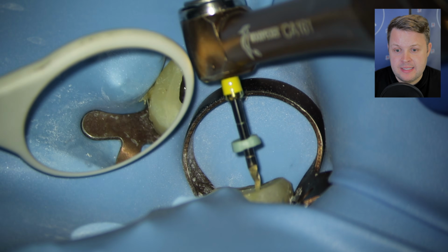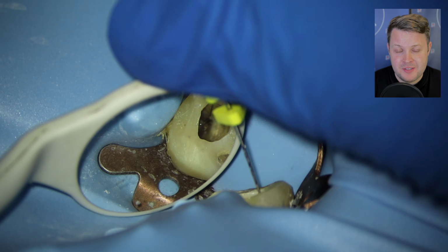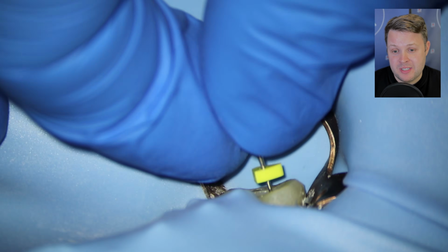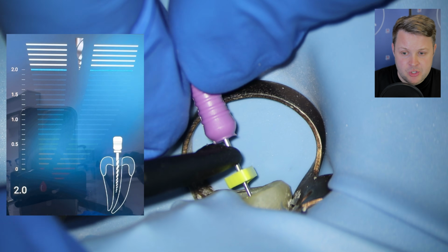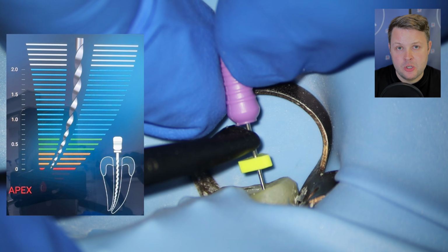Using the size 20 high flex, again, make sure there's no unwinding of the flutes, because you'll separate this file, and then you're up a different type of creek, the proverbial creek. And again, it's the same with the MB. We're using this D-finder. It's going really nicely to length. It's pushing past the original GP. We hook up the apex locator. We're through. We're just going to push it back and forth, in and out.